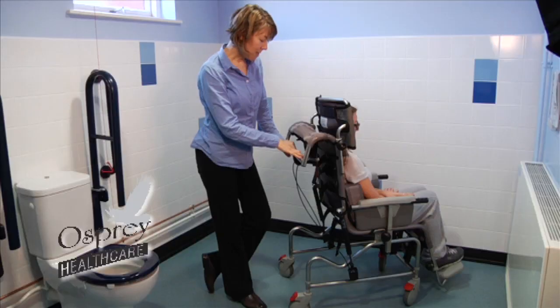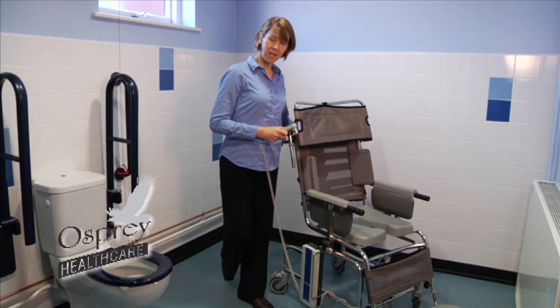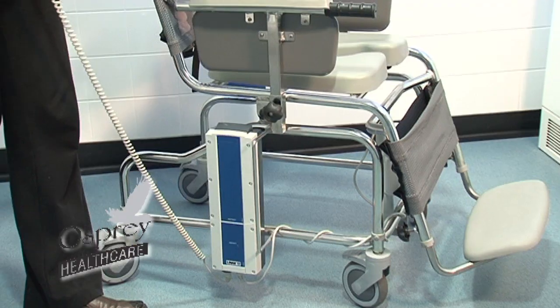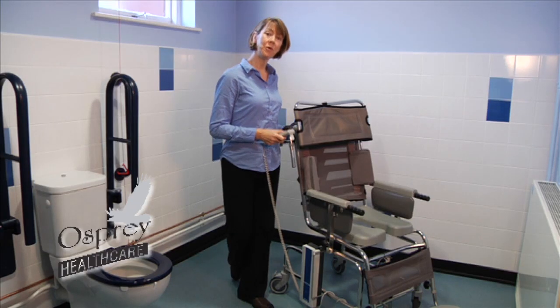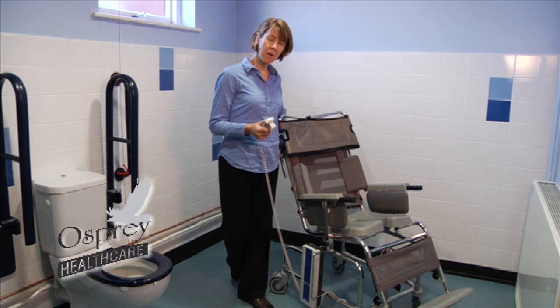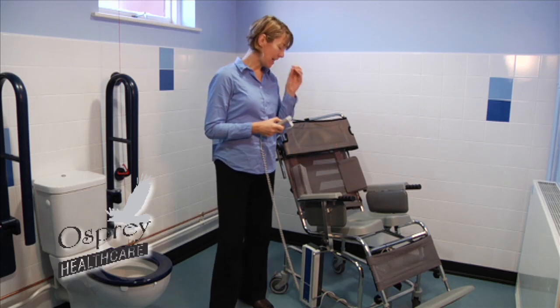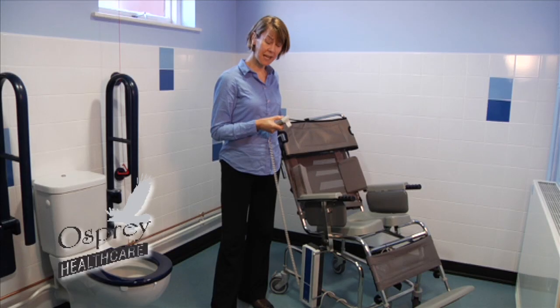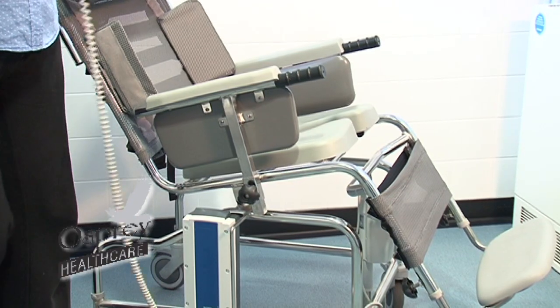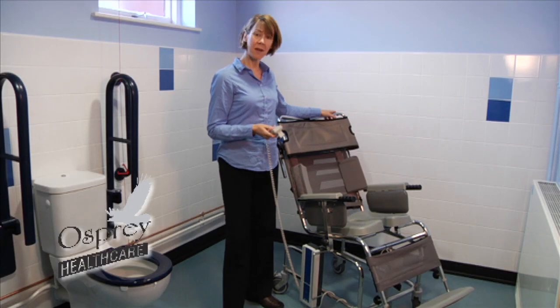For people that are heavier, it may be that you want to consider the electric version of this chair. We have the powered tilt-in-space shower chair and commode here. It comes in a range of sizes, and we can also put the battery pack onto the shower cradle. Instead of having to release the brake and push down to tilt this product, you just press the handset. You might want a powered product rather than a manual one if the person in the shower chair is very heavy, or if the carer — perhaps a family member — is themselves quite short, light, and frail, and might really struggle to get the power needed to push down at the back.